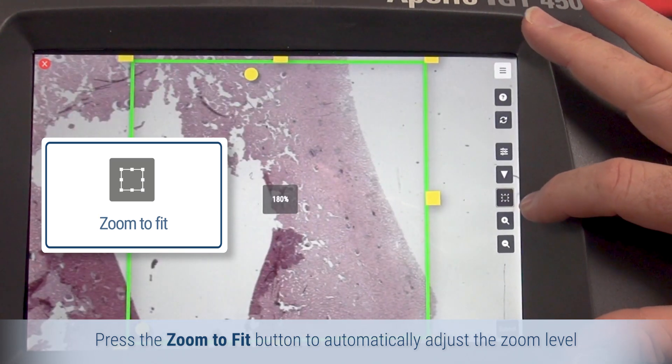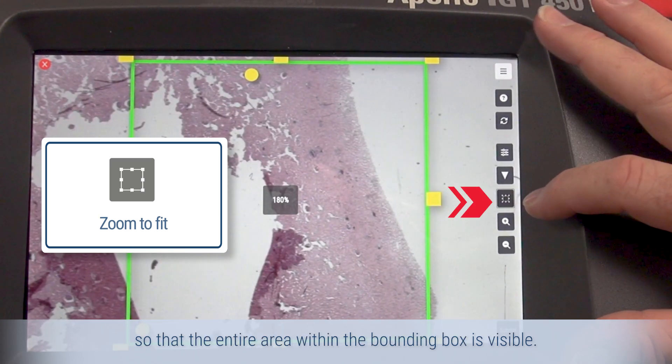Press the zoom to fit button to automatically adjust the zoom level so that the entire area within the bounding box is visible.